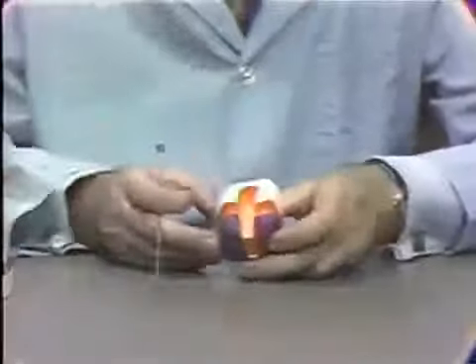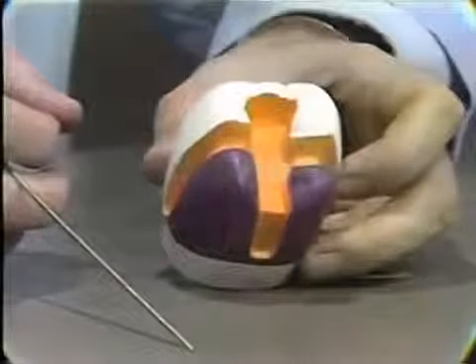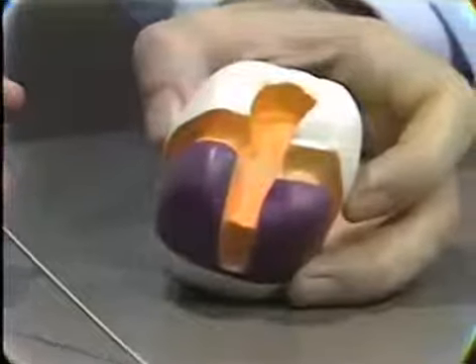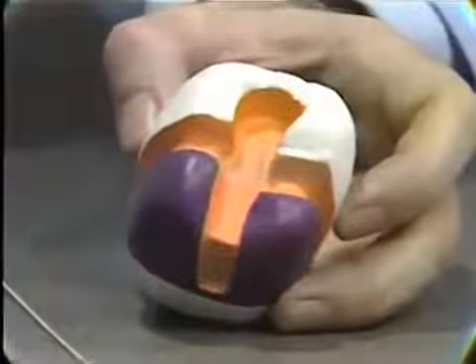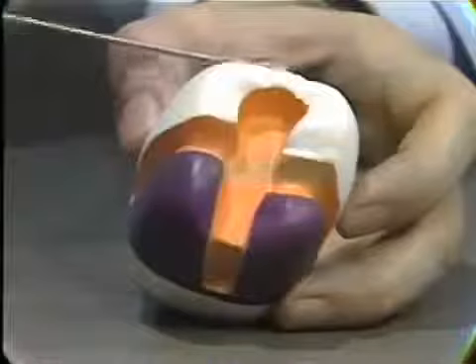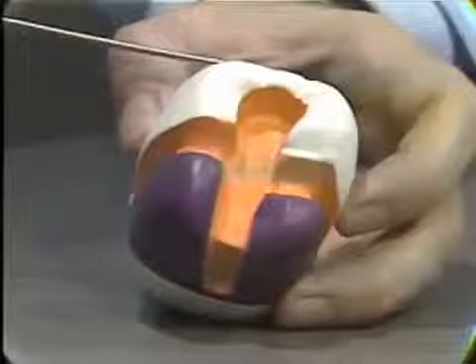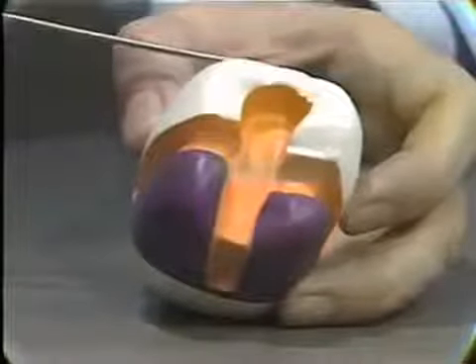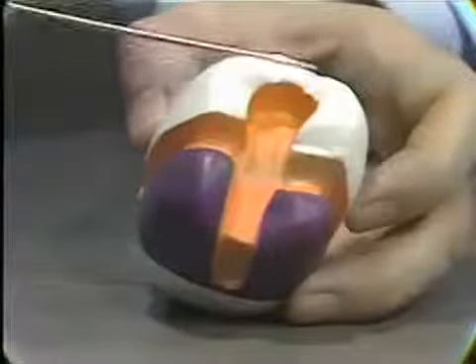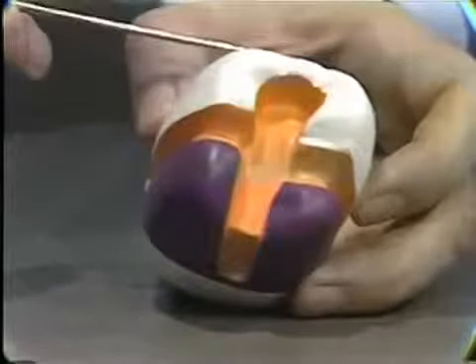Another modification of the three-quarter crown is the mesial three-quarter crown, or sometimes called the mesial half crown, and you see an illustration of this preparation here. It's usually done on a molar tooth, usually a mandibular molar tooth, and it's a particularly good preparation where for one reason or another you do not want to be involved in the distal surface of the tooth in doing the preparation. If there's no previous restoration, no caries here, and possibly a difficult contact relation on the distal or a difficult soft tissue relation, or a problem of an external undercut in relation to the adjacent tooth. All of these situations point to avoiding preparing that surface.